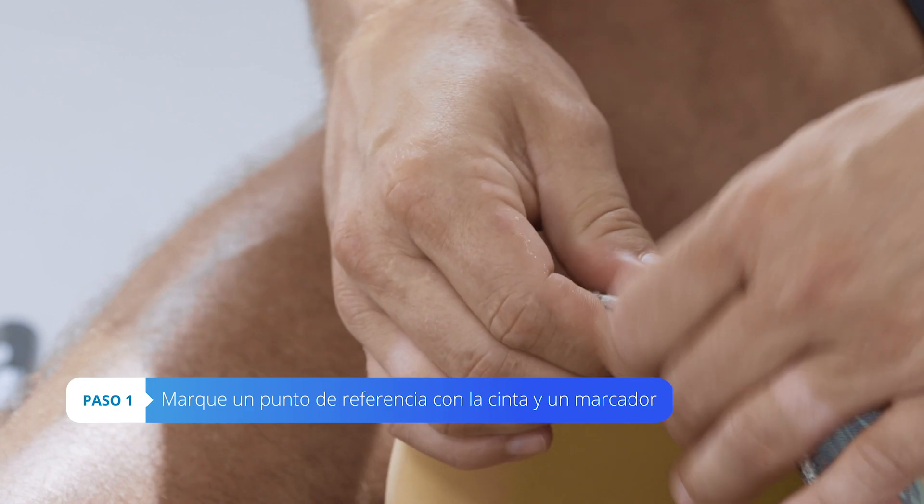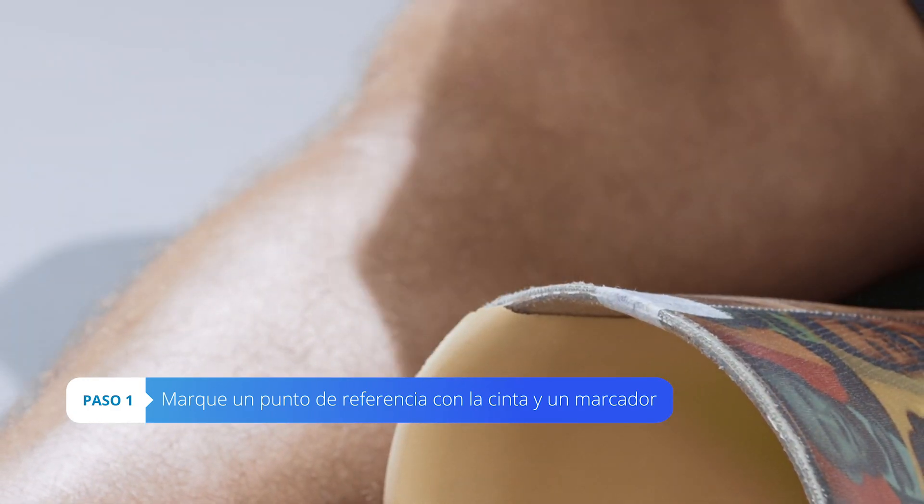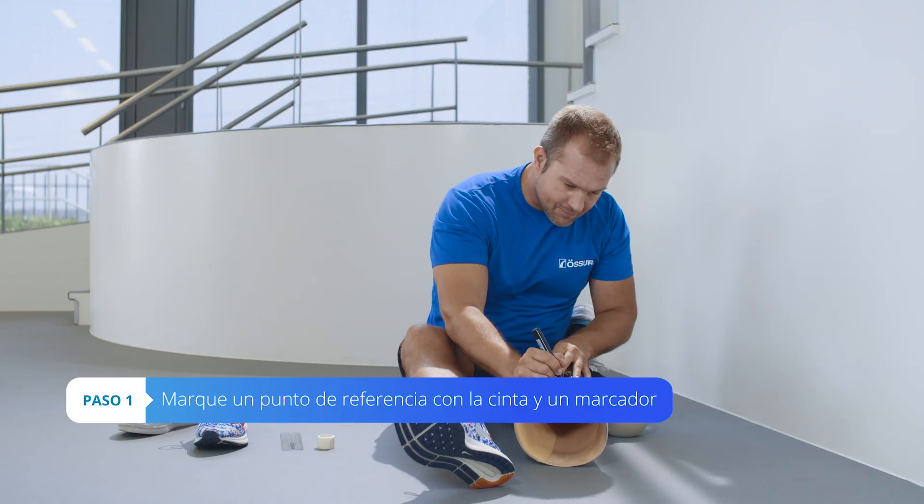Mark the back of your socket with tape. Make a reference point on the tape with the marker.